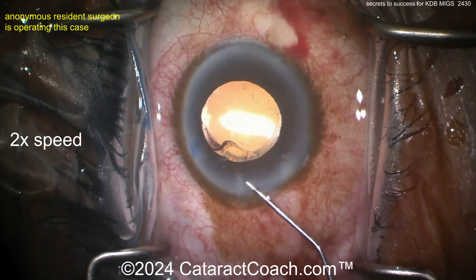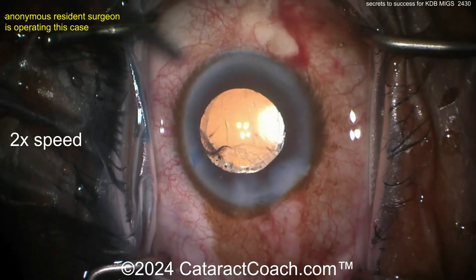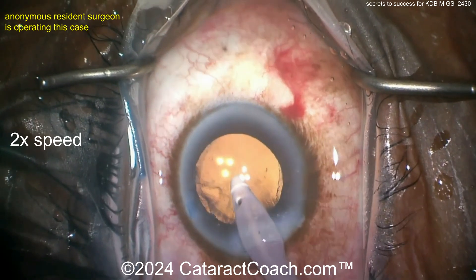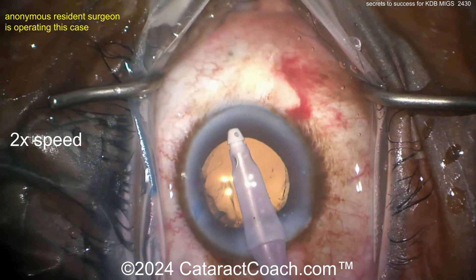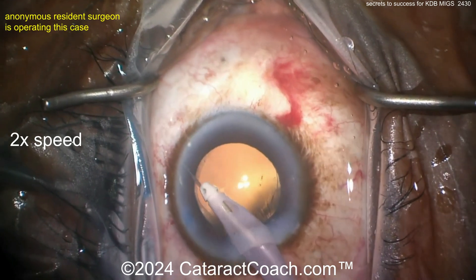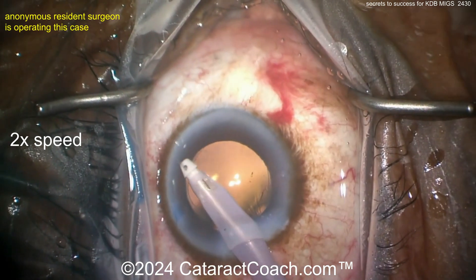Going inside the eye with the IA probe — first hydrating up the incision. I like the sides, but I like the roof a little bit more. Then the IA probe goes inside to take out viscoelastic, perhaps going behind the optic as well to really remove all that viscoelastic.